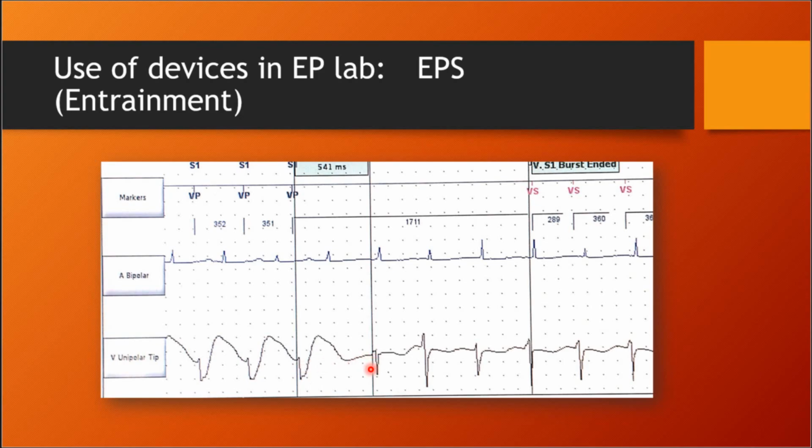If we take the time between the last pace beat and the next ventricular beat, the post-pacing interval, and we subtract it from the tachycardia cycle length, we'll see the distance of entrainment location from the reentry circuit. And this distance, which is PPI minus the TCL, tells us more about what we're seeing.